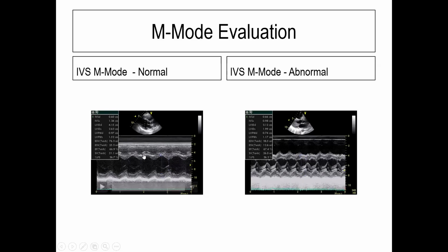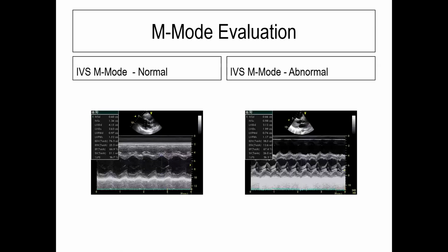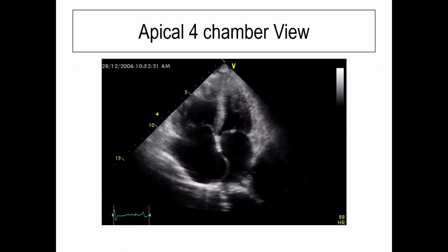It's not possible. So what do we do? Look at this picture. This picture is pretty smooth, sickle shape contraction. This picture is not smooth. In fact, it has two contractions at the same time. These are qualitative, and this is an era not of qualitative evolution. This is an era of quantitative evolutions. So what do we do in a quantitative evolution?